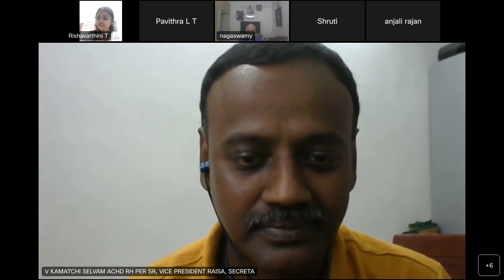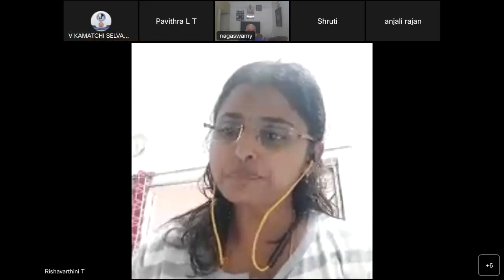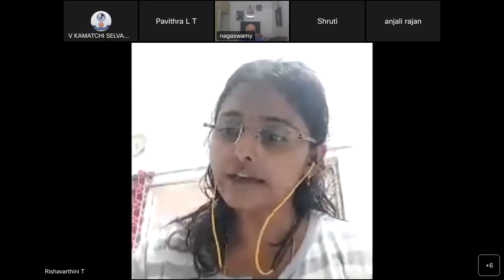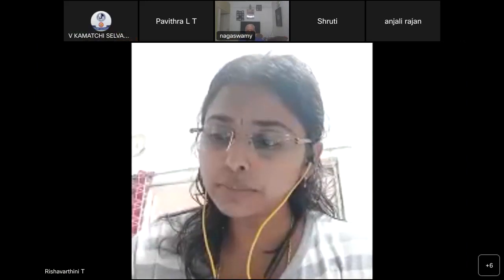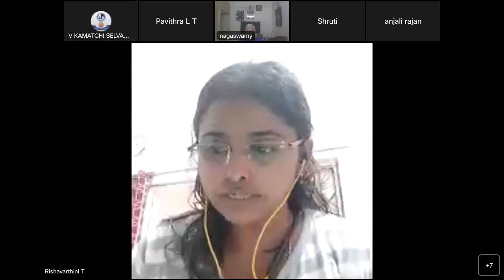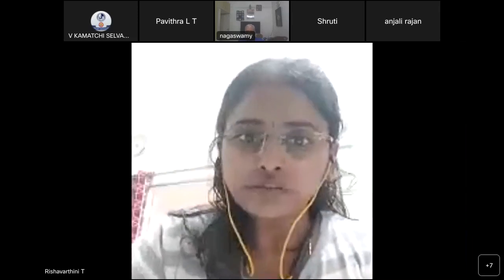Today I will be presenting the first question, DISE, drug-induced sleep endoscopy. DISE is a diagnostic tool to assess the upper airway of snorers and OSA patients in conditions that mimic natural sleep. OSA is a common health problem that is associated with an increase in serious morbidity, mortality, reduced quality of life, and higher risk of hypersomnolence.